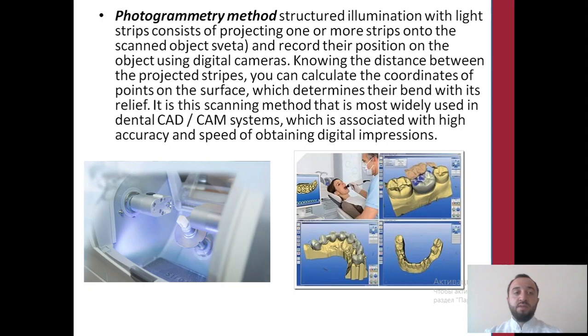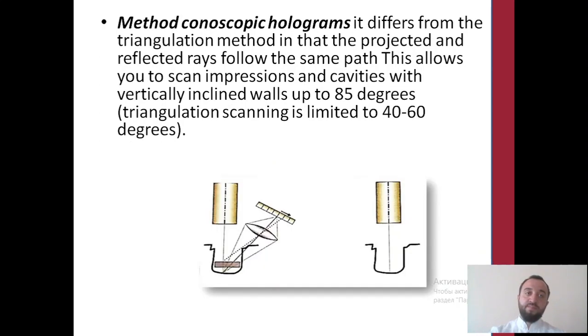Knowing the distance between the projected stripes, you can calculate the coordinates of points of the surface, which determines the object with its relief. It is a scanning method that is most widely used in dental CAD/CAM systems, which is associated with high accuracy and speed of obtaining digital impressions.